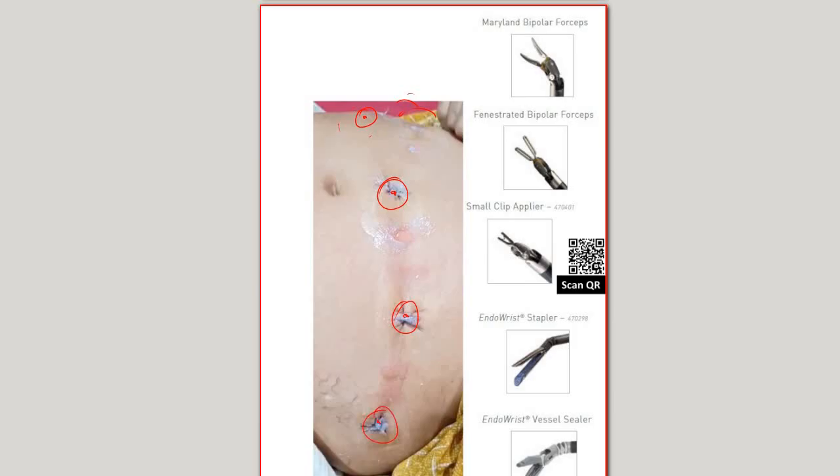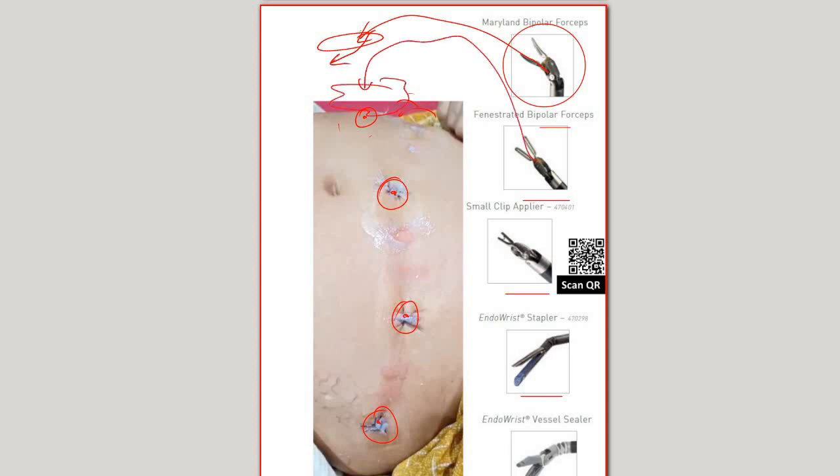Now next we will have different types of forceps. So this will enter the human body based on whether they have to cut or remove some muscles. So suppose this is a muscle, one of these goes inside, it slowly shifts the muscles, then the next arm goes inside and does the work of cutting the uterus out, something like this. And then there is another arm with the camera, which is already observing what the 2 arms are doing slowly and gradually.